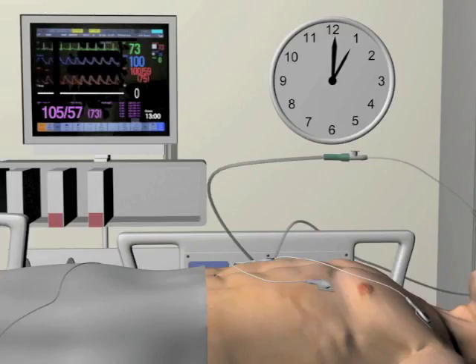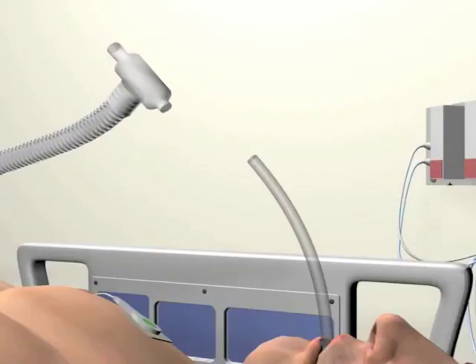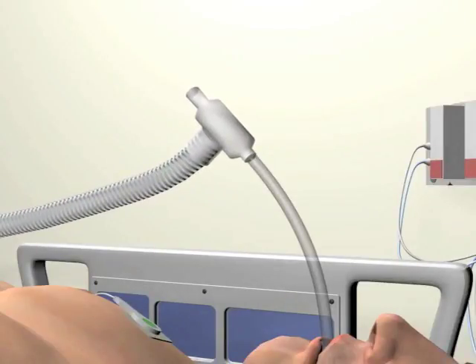As the apnea testing is coming to completion, a final blood gas should be sent prior to reconnecting the mechanical ventilator. When the mechanical ventilator is reconnected, the respiratory rate should be turned up to somewhere between 16 to 20 breaths per minute in order to hyperventilate the patient and blow off the carbon dioxide in order to avoid post-apnea test hypotension from respiratory acidosis.